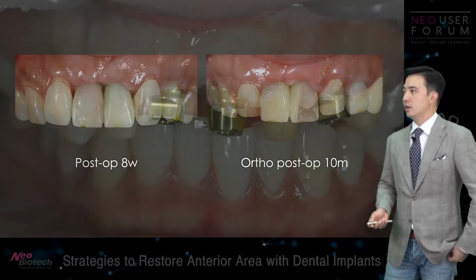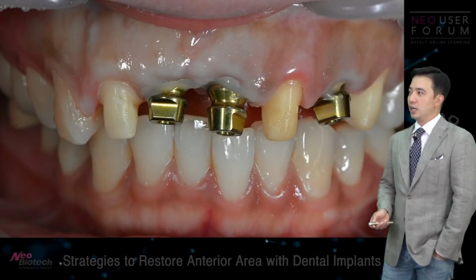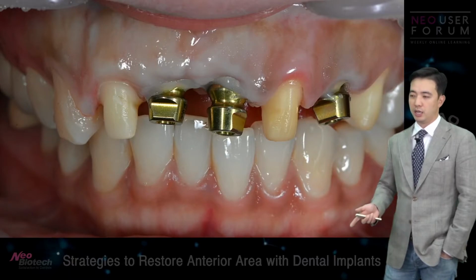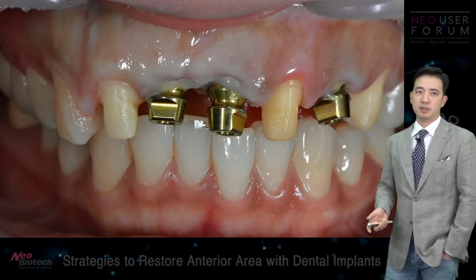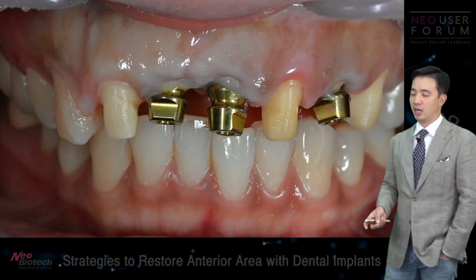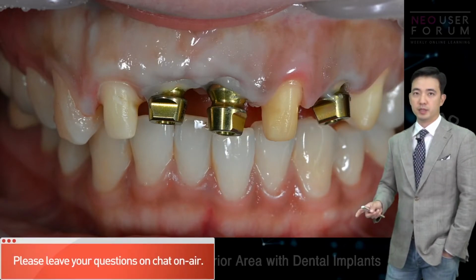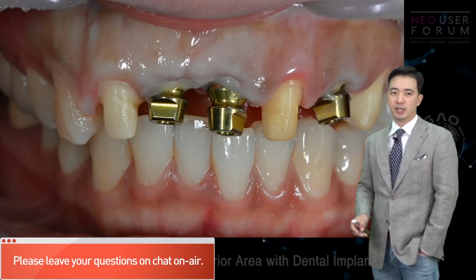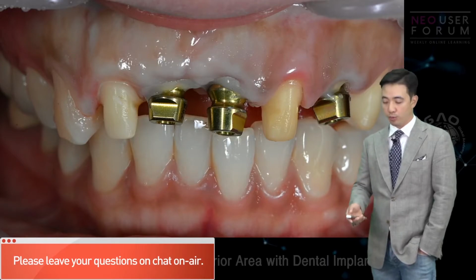Okay, so at this stage I thought, okay, I would try a zirconia abutment before we go to the final restoration and just see how the emergence profile gets a little better. If it doesn't, the last thing we can do is just use pink porcelain, okay?